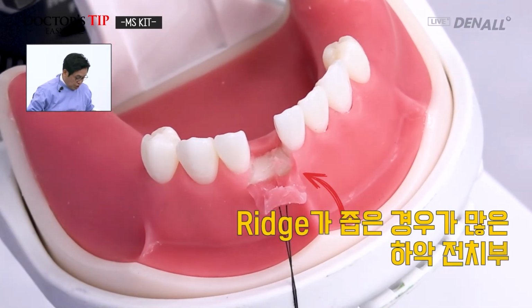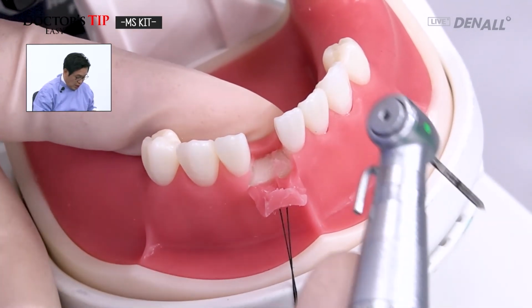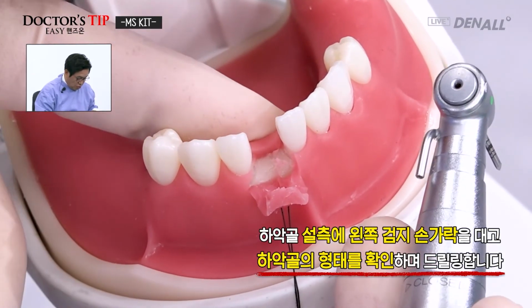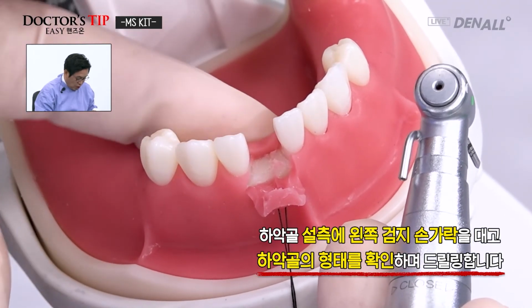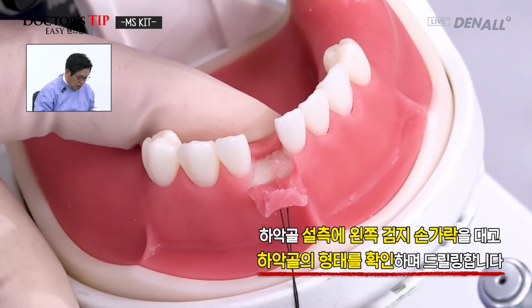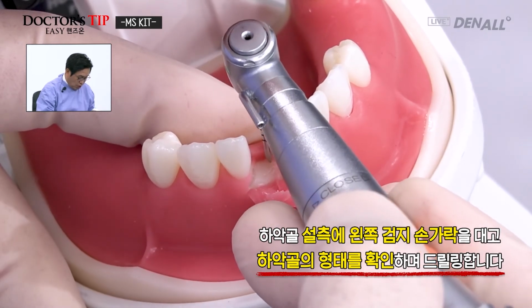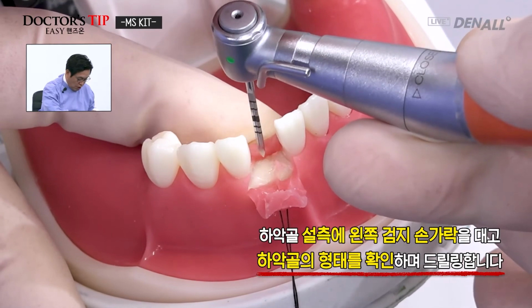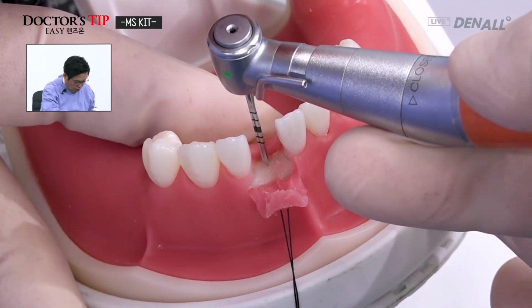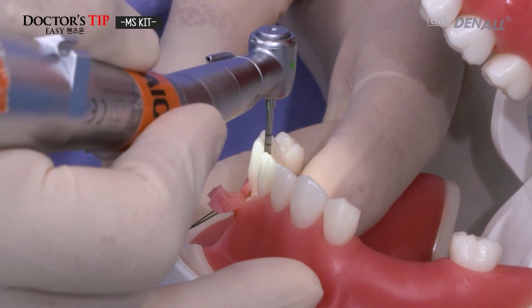Generally, when you place an implant in the lower anterior side, there are a lot of cases where the ridge is narrow. So to push lingually, on the mandible lingual side in the area I want to place, the left forefinger is put, so I can drill while feeling the bone contour. Leaning toward the crest, I go through the lingual crestal bone, so I position it, and for the missing part at the center, I go more on the lingual side for drilling.